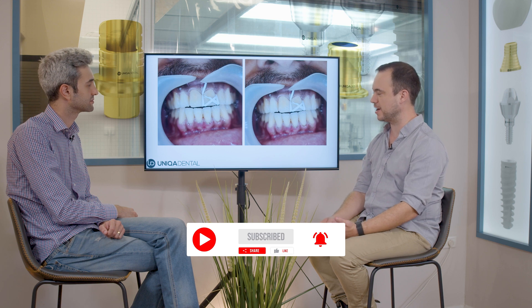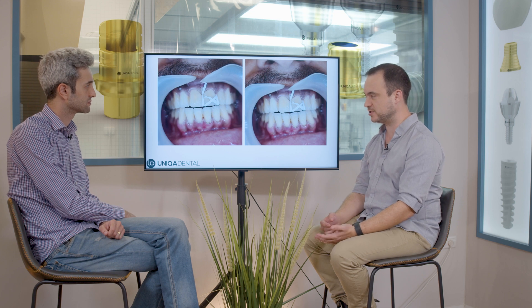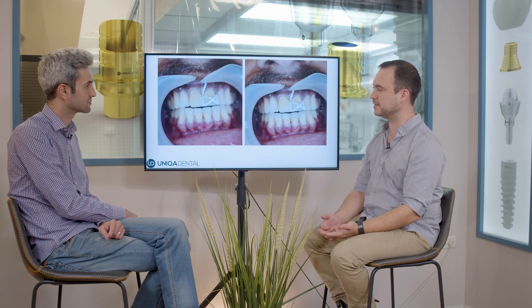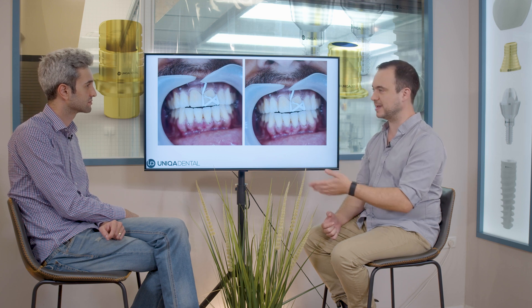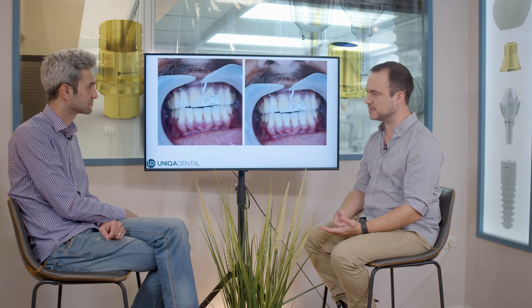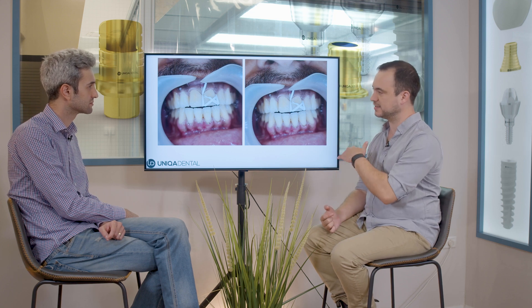Then we took impressions on the post and cores and prepared zirconia crowns. Here you can see the crowns after the glaze, after the whole process. The main problem when cementing crowns is the residues of the cement — it gets stuck between the teeth or between the crown and the gingiva. So before we cement the crowns, because it's a bridge, you can't get in with a tool to clean the cement residues.